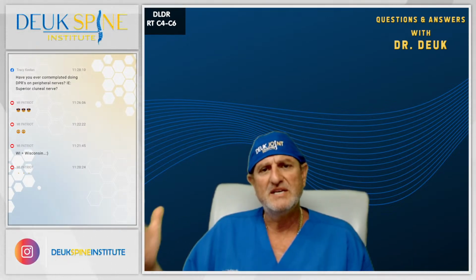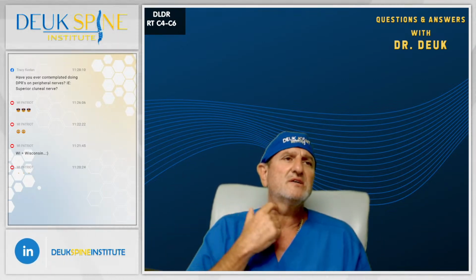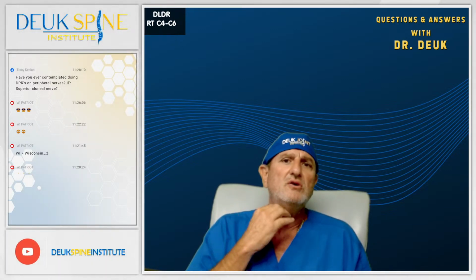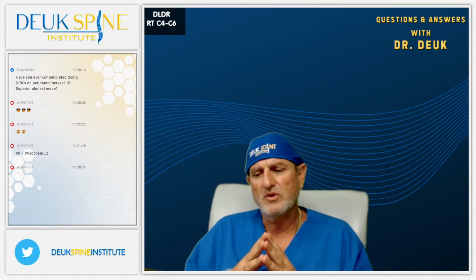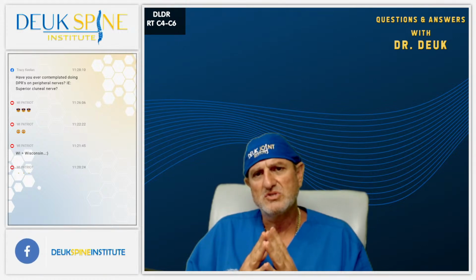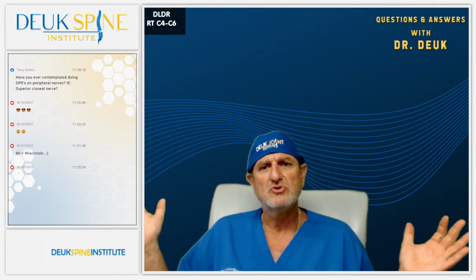But when you have an ACDF fusion or artificial disc, those surgeries are extremely invasive. The surgeon has to cut your neck, dig around in the muscle, cut the strap muscles and move the trachea and esophagus over, separate it from the carotid sheath and its contents, and the sternocleidomastoid muscle. So there's a lot of trauma happening with open neck surgeries. None of that happens with this surgery. That's why there's no bleeding, there's no pain.